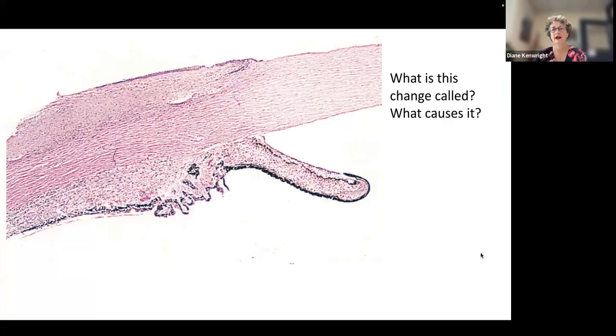All right, and then finally, the anterior part of the eye. You'll be able to see here the iris with a not really prominent neovascular membrane on the anterior surface, and an ectropion iris adherent to the posterior cornea, and the trabecular meshwork is here. So this is classic neovascular glaucoma.